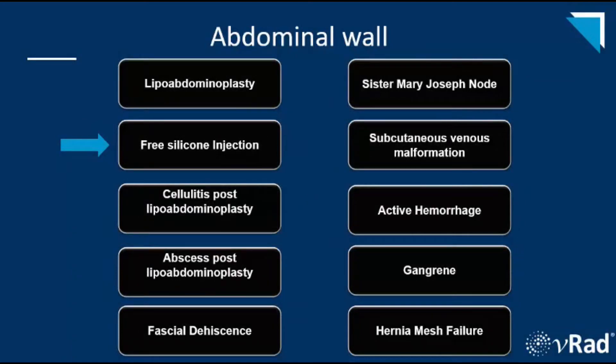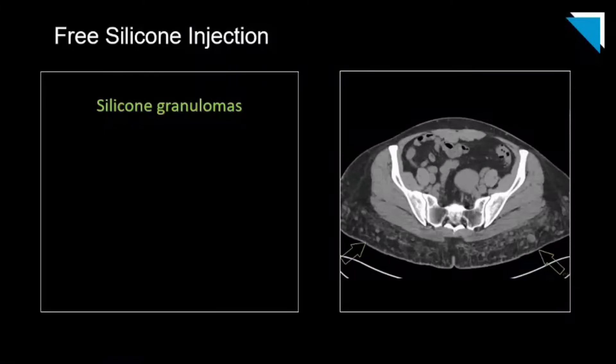Our next case is an example of free silicone injection. This axial image shows the typical postoperative appearance of liquid silicone injection. These multiple round densities in the gluteal soft tissues are silicone granulomas. Keep in mind these can calcify or be confluent. You can see these pretty much anywhere, but breasts and buttocks are the most common. Also note the midline crowding of the rectus abdominal muscles signaling a prior abdominoplasty.